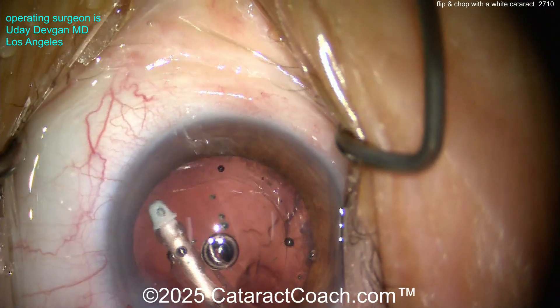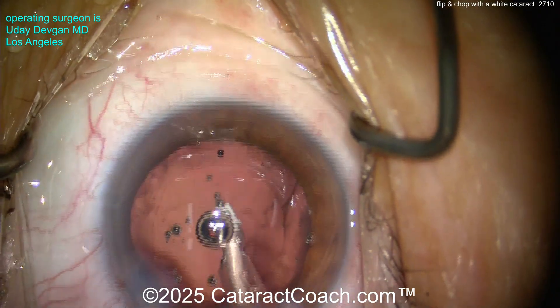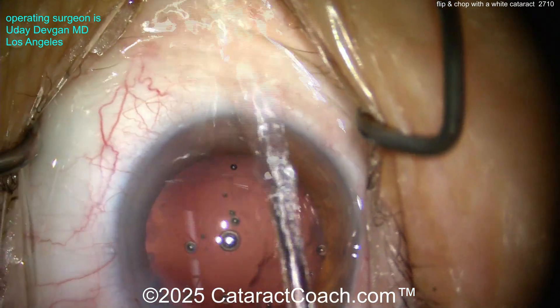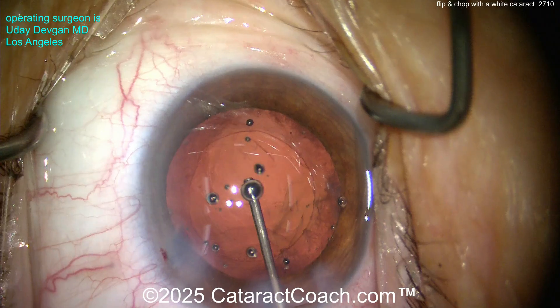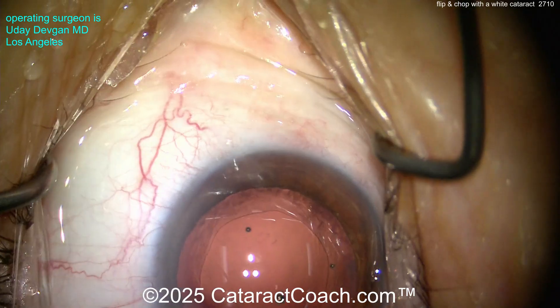This technique — flip and chop — is not for new surgeons. If you're a beginning surgeon who has done fewer than a thousand phaco cases, don't do this. You need to first learn divide and conquer, stop and chop, horizontal chop, and vertical chop. Do all of those first, and then come and learn flip and chop.